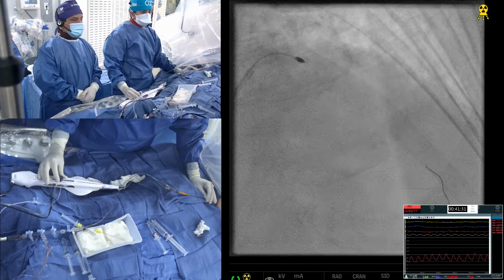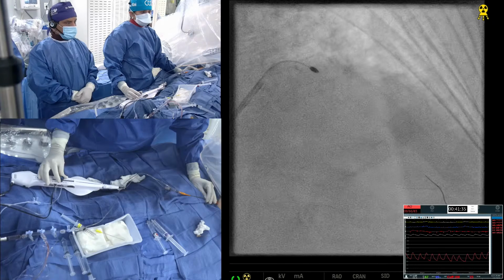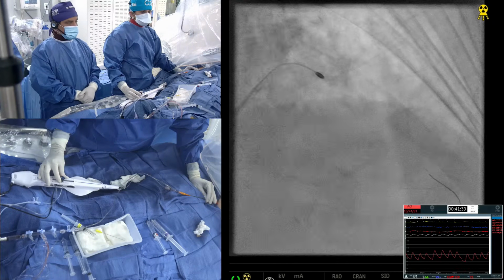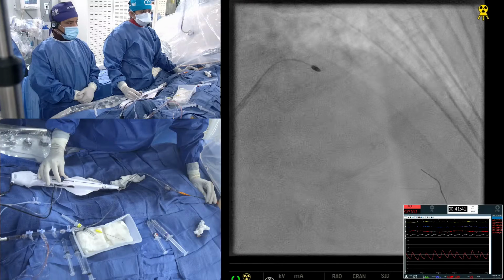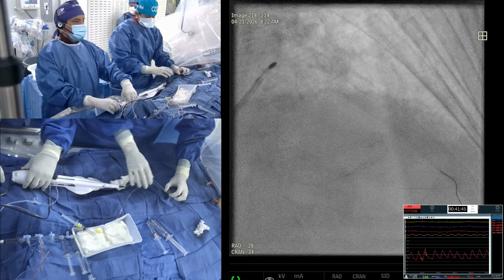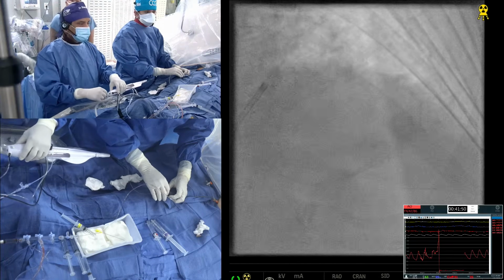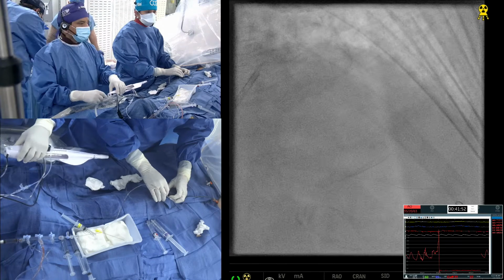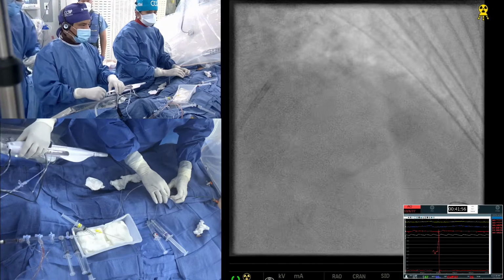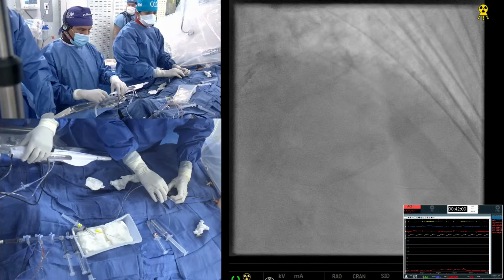150, 150, 5 seconds. I think it comes out. Going. 150, 10 seconds, 150, 150, 15 seconds. So okay, ready? For our viewers, they should observe how this maturity and decades of experience teaches you that look, you know, the proximal is done. Let's not push too far. That is correct. Yeah. Bring back the wire.